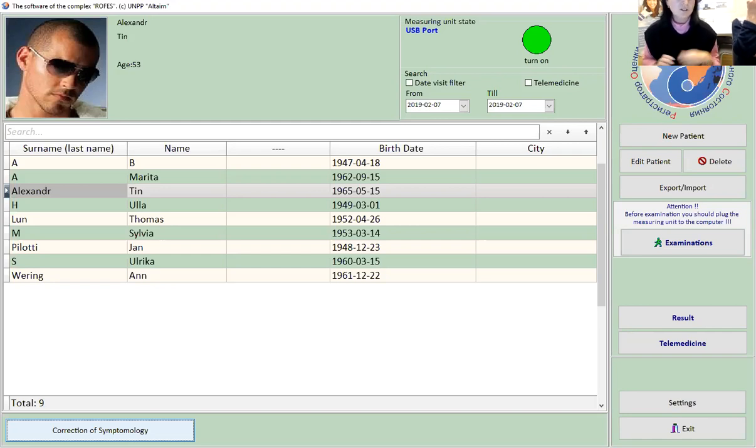And then I just give the client, if it was a parasite, the parasite stripe. I also check after this treatment which organs were jumping, and write down maybe some correction by symptomology for the client to take with him, so he can be treated himself during the days that he will not be coming.